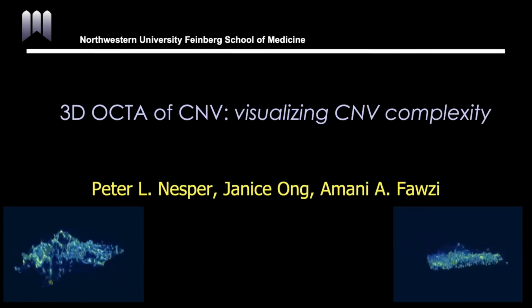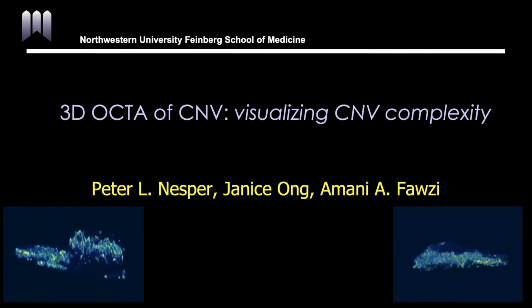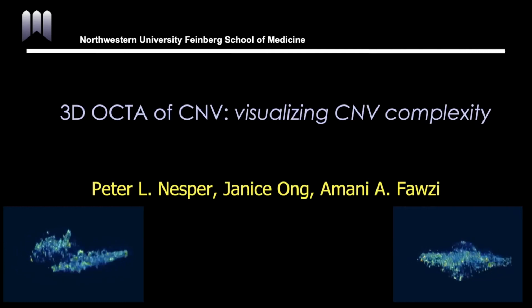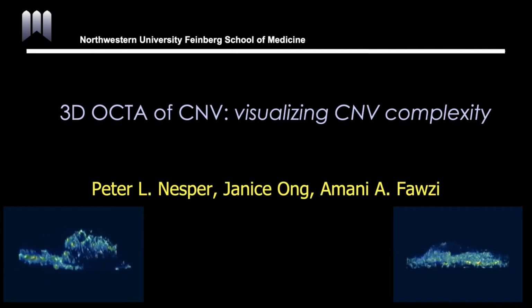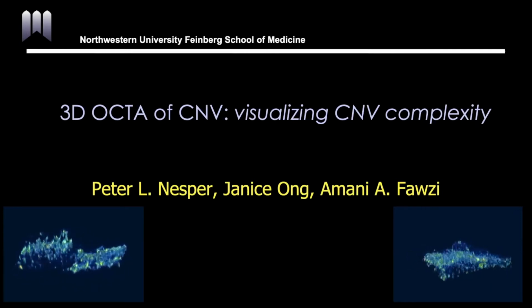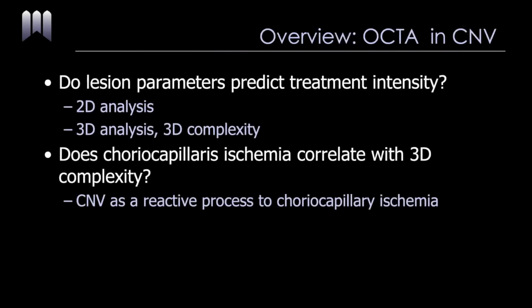Today, I'd like to tell you about what we've learned from analyzing choroidal neovascular membranes in 3 dimensions. This is a powerful technique that's facilitated by OCT angiography. I have no relevant financial disclosures.